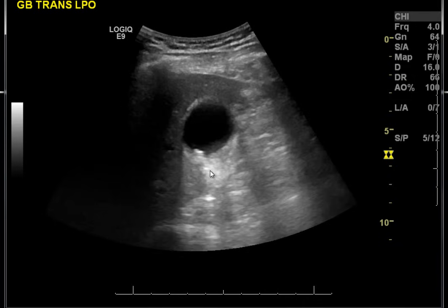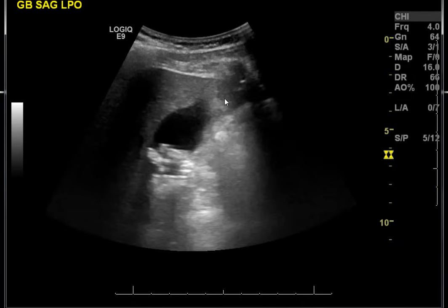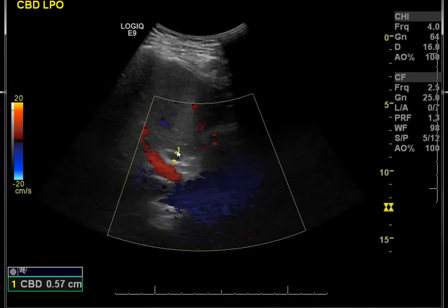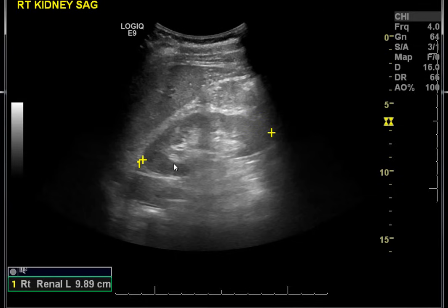So: gallstones with normal gallbladder walls. Again, they've added color to find the common bile duct, which is anterior to the portal vein, and they can measure it. They measure it from the margin of the common bile duct to the opposite margin — it should be leading edge to leading edge. We'll talk about that when you come in.